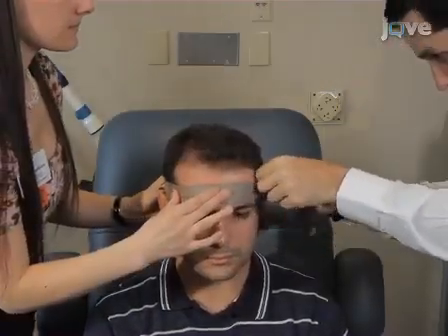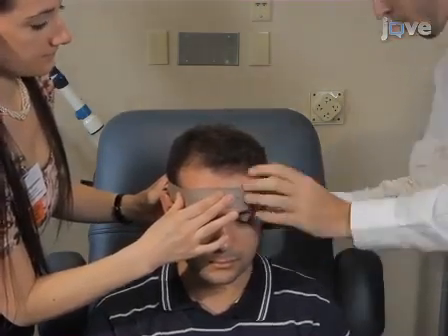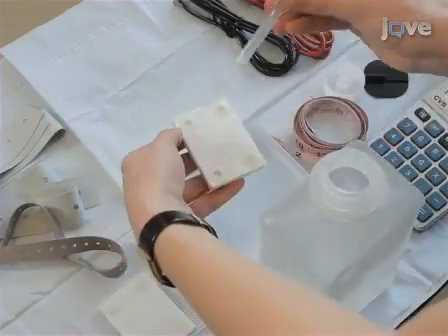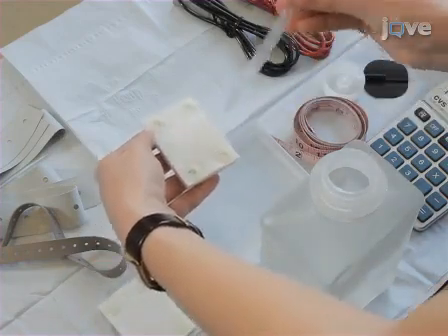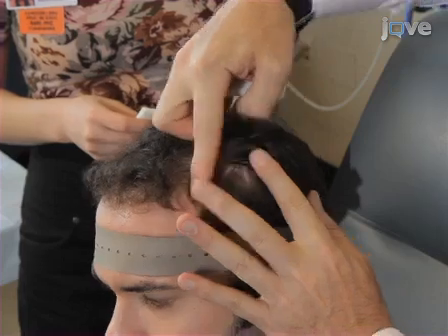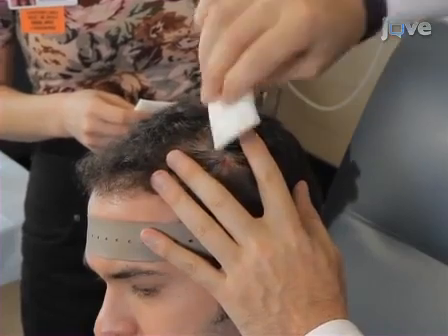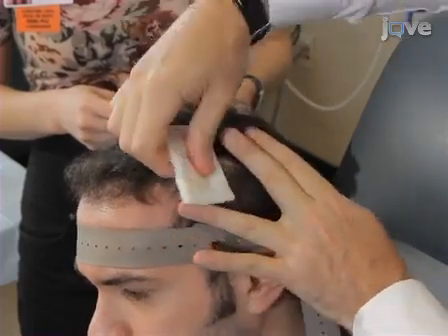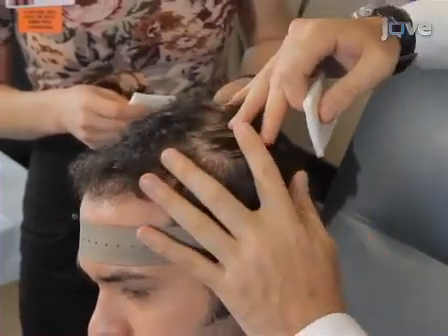Before placing the electrodes, place an elastic or rubber head strap around the subject's head under the inion; this will secure the electrodes and reduce movement during stimulation. Next, prepare the sponges by saturating each side with saline solution. For a 35 cm square sponge, approximately 6 ml of solution per side should suffice. Inspect the skin where electrodes will be placed for signs of irritation. In case of any visible lesions, do not apply TDCS in that area. To increase conductance, move hair away from the electrode sites, clean the surface of the skin, and allow it to dry.